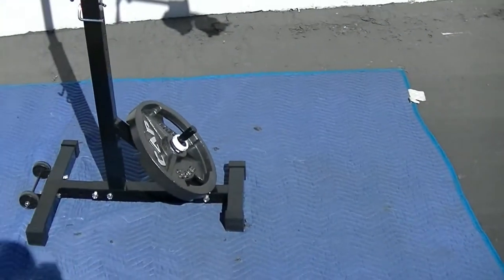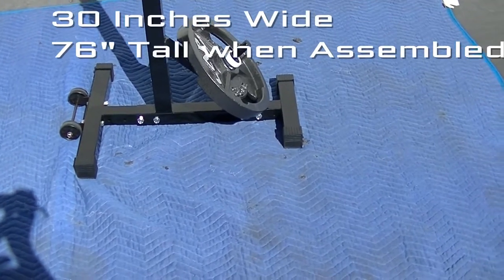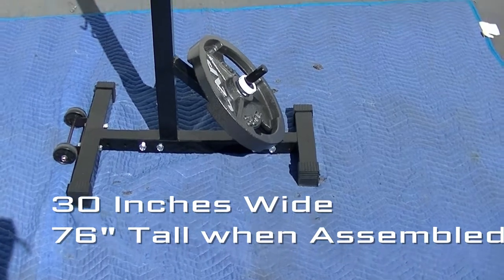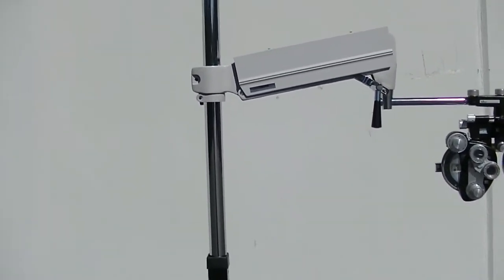The dimensions: it's 30 inches from the edge of the wheel to the edge of the support — 30 inches wide. And it's 6 feet 4 inches tall when fully assembled.